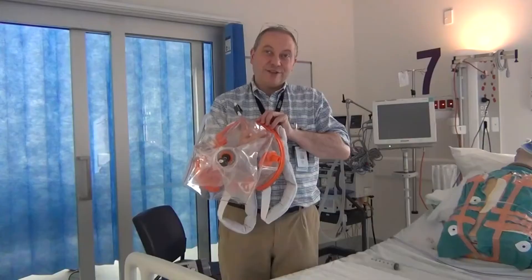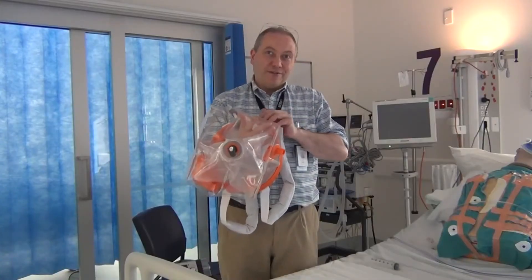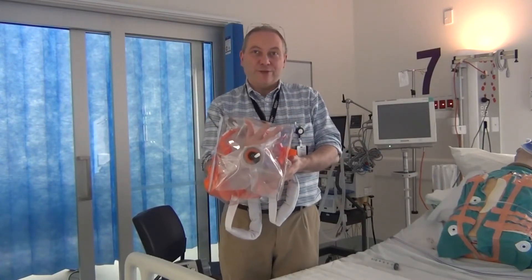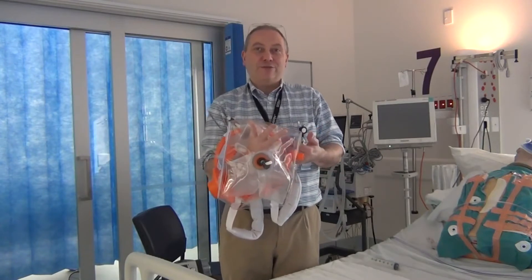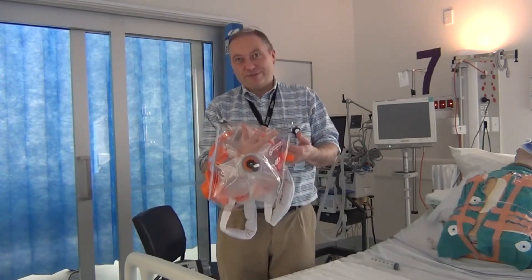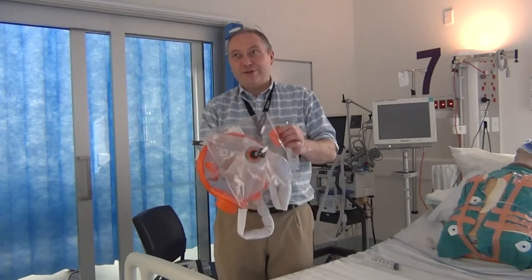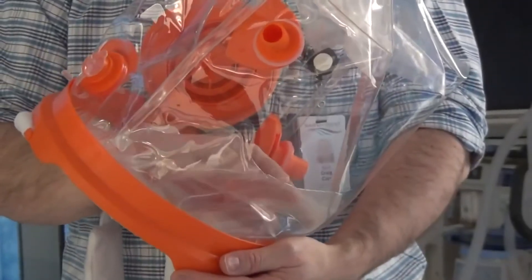These cushions serve two functions. First of all, by inflating them you reduce the dead space volume of the helmet and that in turn reduces the gas flow required to prevent re-breathing. The second function they have is one of comfort, affording cushioning to the patient when they move.